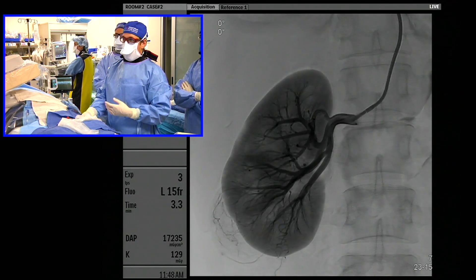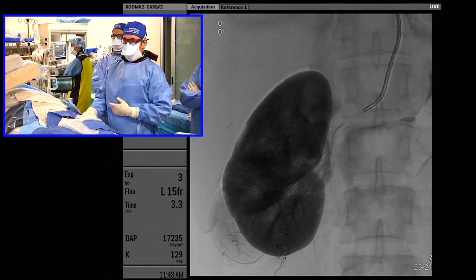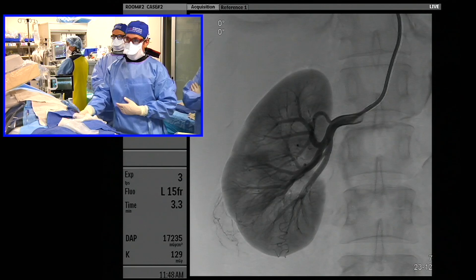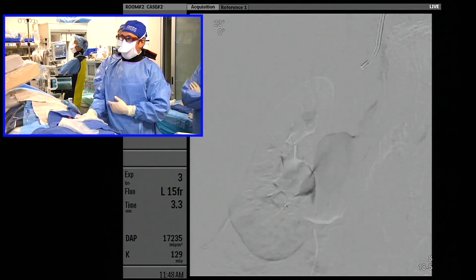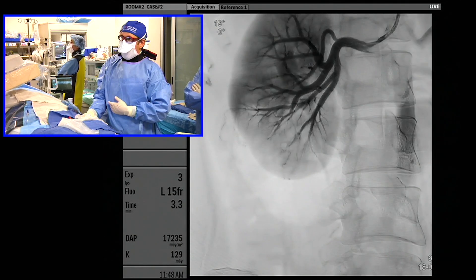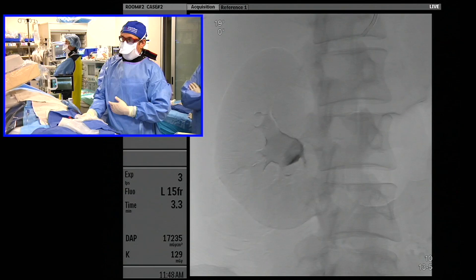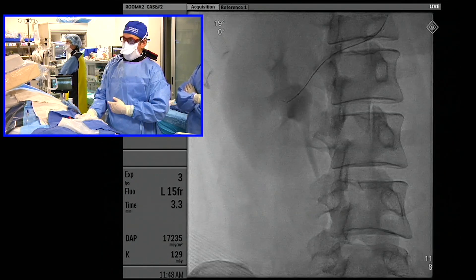You can see the AML at the bottom — there are a couple of different feeders. It's not a very vascular one; it's on the smaller side. We could debate whether something like this needs to be treated, but it's above 4 centimeters. We accessed a little further, did an oblique, and determined while we were listening to Angela's talk that it was coming off one of those mid-branches.